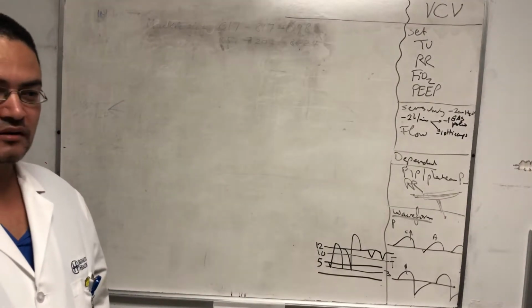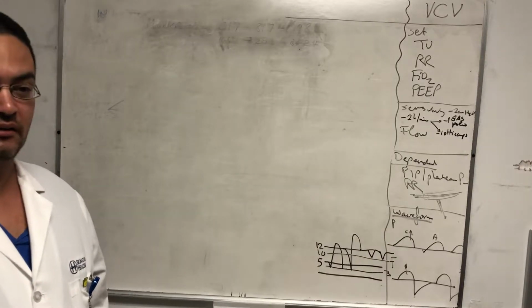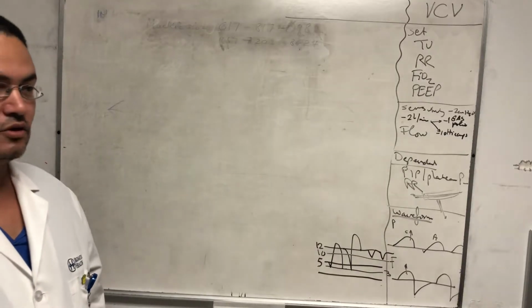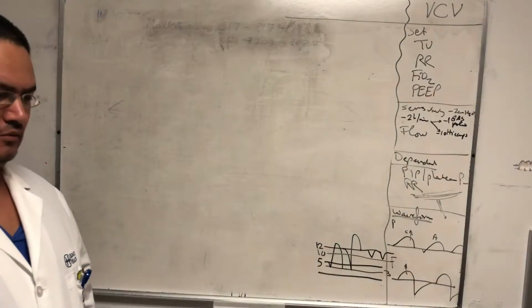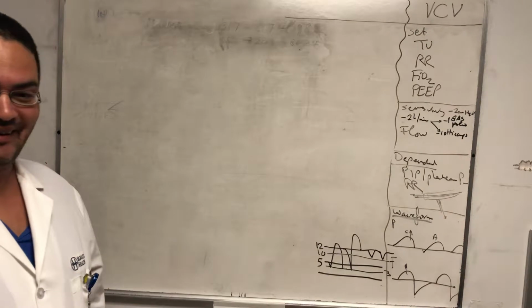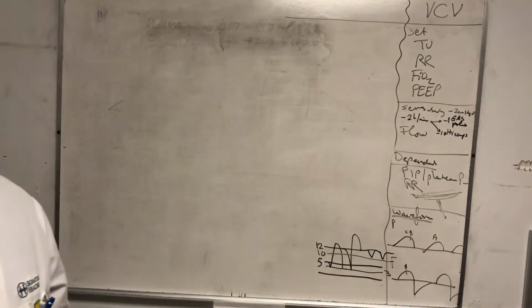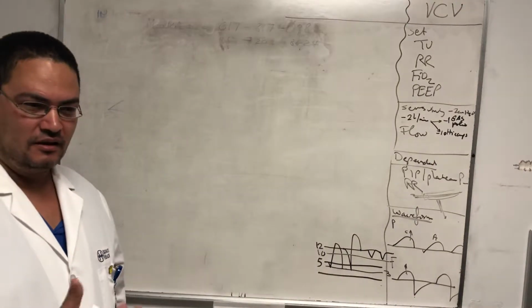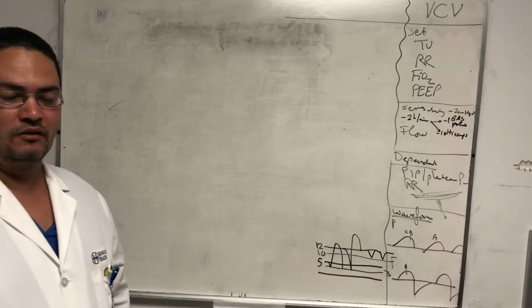Another one, after a bronch, the lady was taking a breath rate of 105 breaths per minute. We didn't know what to do. So I said, "Give me the paralytic." So I got the paralytic. Still 105. Still breathing at 105. So it's not her. Something else is happening. It could be something like a ball valve type thing, or some secretion at the endotracheal tube level or something. We didn't know what it was.